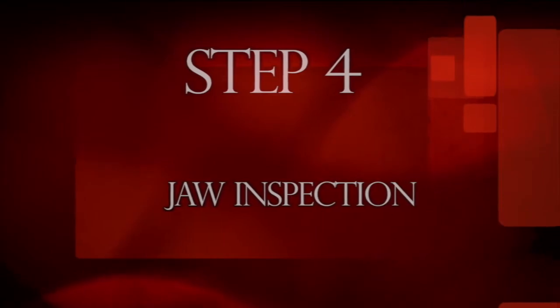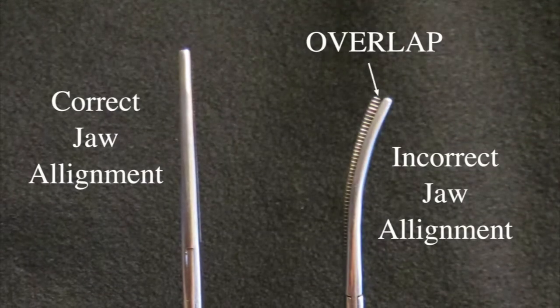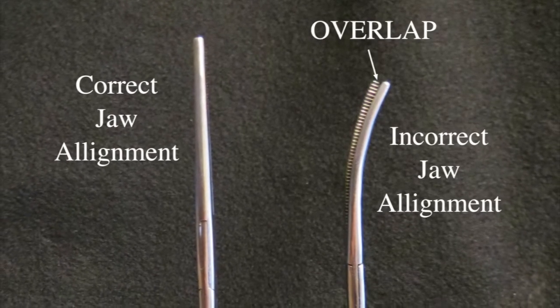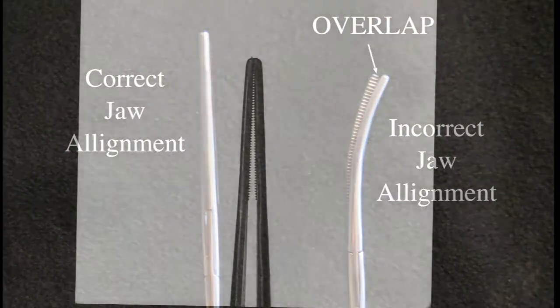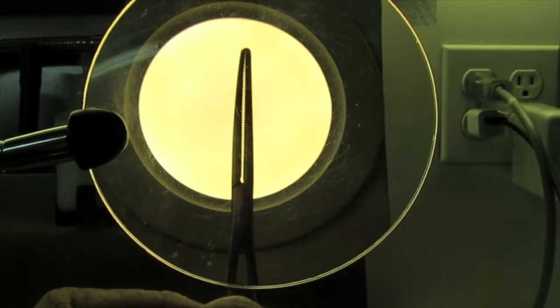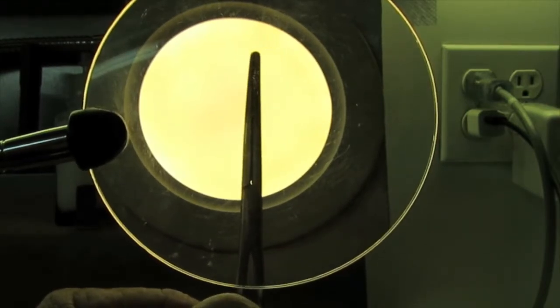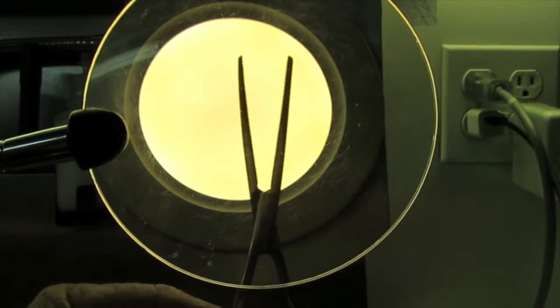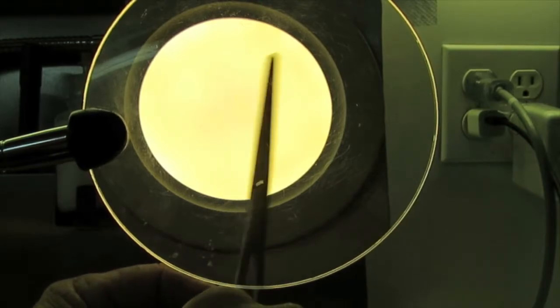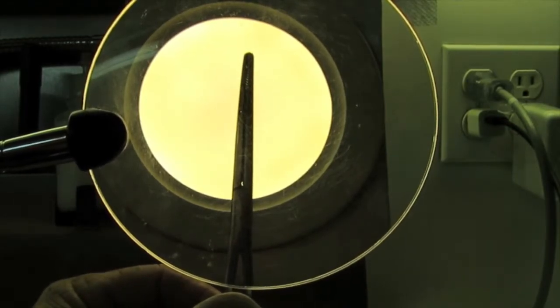Step four: jaw inspection. First, inspect the jaws from the side to ensure that the jaws do not overlap. Note the side alignment of these two instruments. A backlight is any bright light positioned behind the instrument during inspection. Position the instrument in front of a backlight. As you close the ratchets, the jaws should close evenly from the tip to the base. With the jaws completely closed, there should be no irregular gaps between the two jaws. Pay close attention to the tips to ensure that they do not reopen when the ratchets are completely closed.